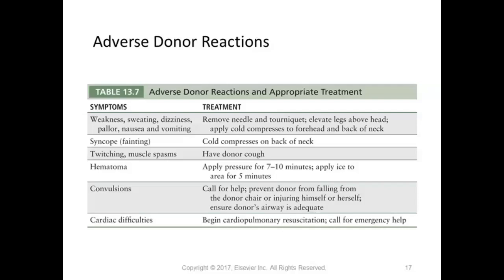And I think we have a bag in the lab. I'm going to have to look, and we can compare the needle size or the bore or the hole of the needle, and you can see what I'm talking about. So of course, if a hematoma forms, they have to apply pressure, and then more than likely that's going to leave some type of bruising as well.